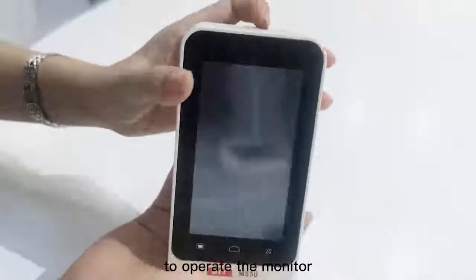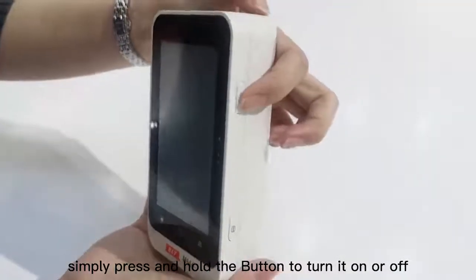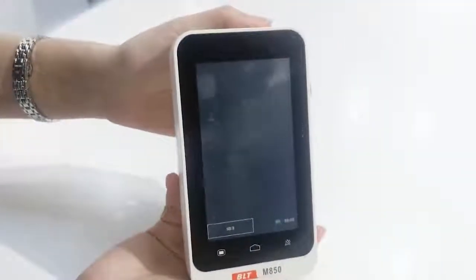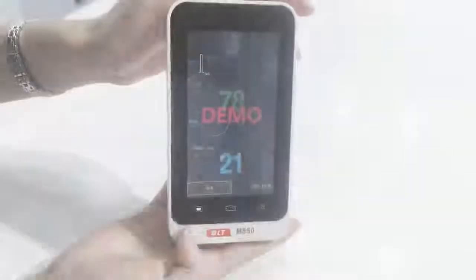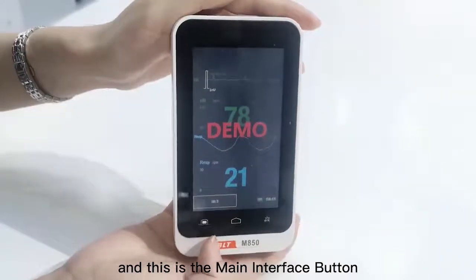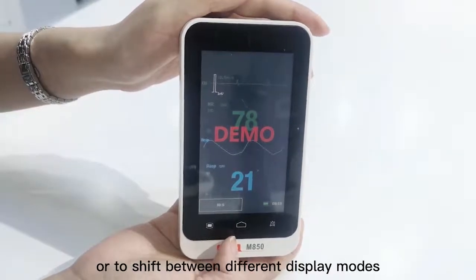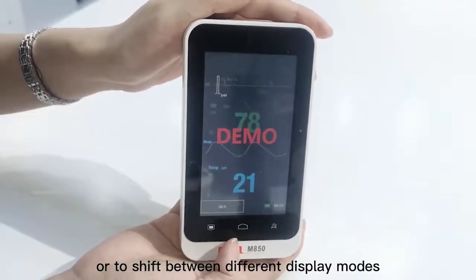To operate the monitor, simply press and hold the button to turn it on or off. This is the menu button, and this is the main interface button. You could press it to return to the main interface or to shift between different display modes.